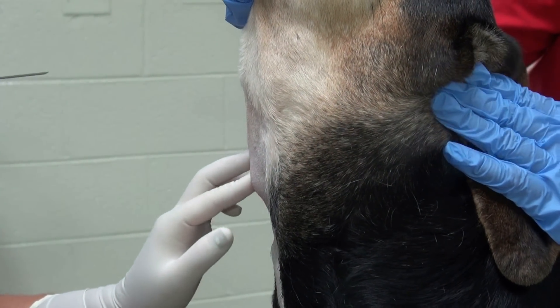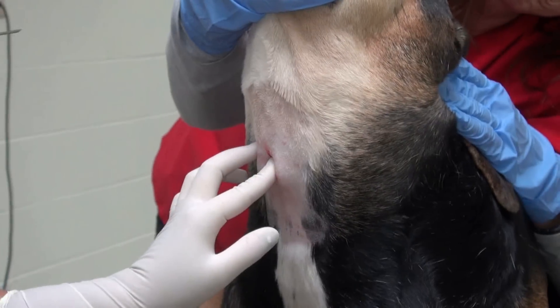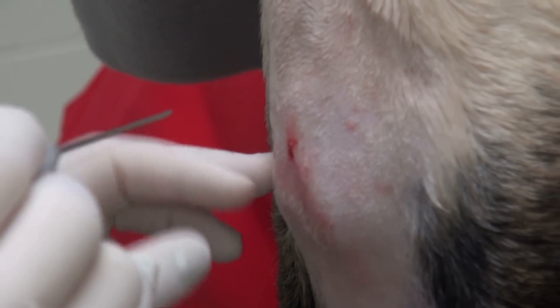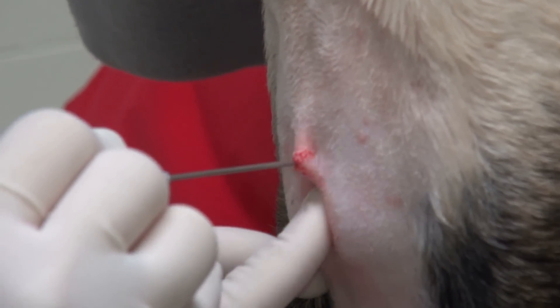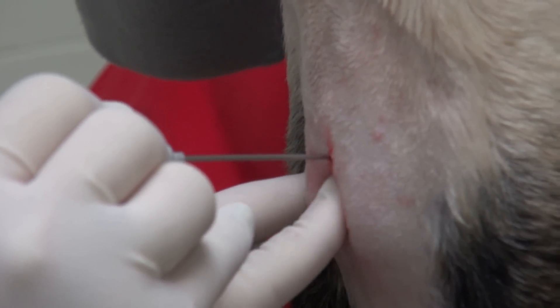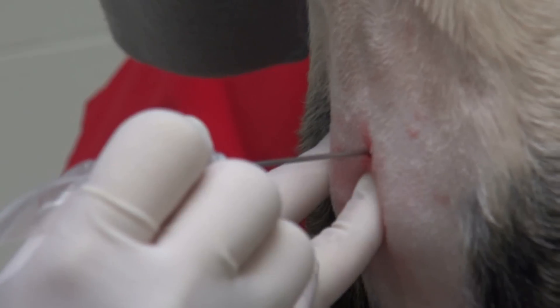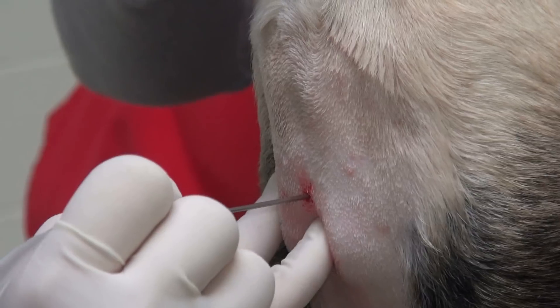Find the landmarks on the dog's neck again. Hold the index finger on the cricoid cartilage right over the symphysis and, with the bevel pointing down, advance the needle through the hole in the skin. Sometimes the easiest approach is to tent the skin with that same hand to lift the wound away from the neck and advance the needle through the skin wound only. Then repalpate the landmarks, get the finger on the symphysis, and advance the needle directly on the midline just over the fingernail as a guide. The needle should go in with minimal resistance, and there is often a small pop as the catheter passes through the cricothyroid ligament.